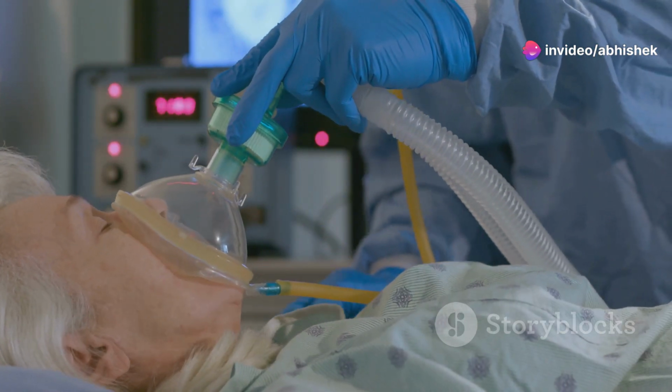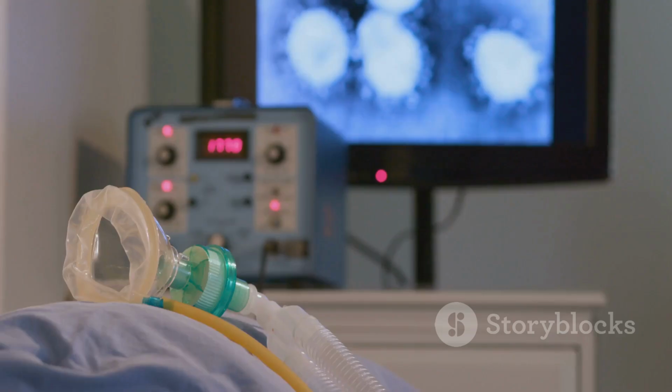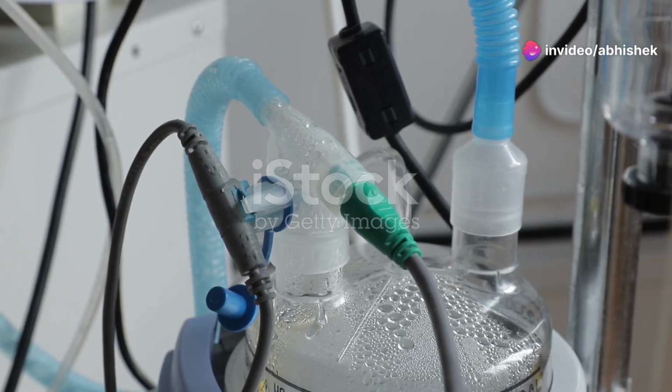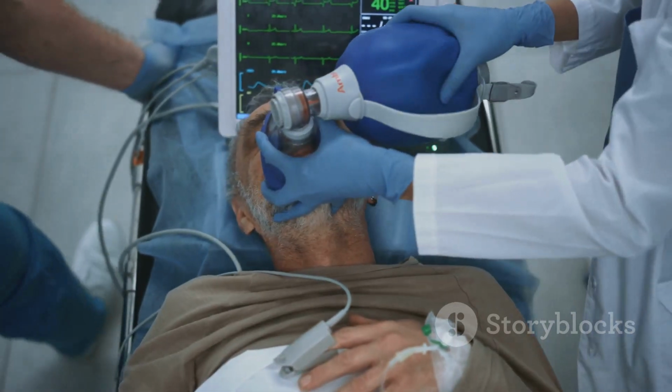The breathing circuit is the bridge between the anesthesia machine and the patient. It's a closed system that delivers the carefully prepared gas mixture to the patient's lungs and carries away the exhaled carbon dioxide. Think of it like a sophisticated set of lungs for the patient while they are under.